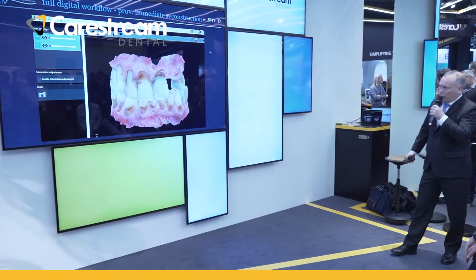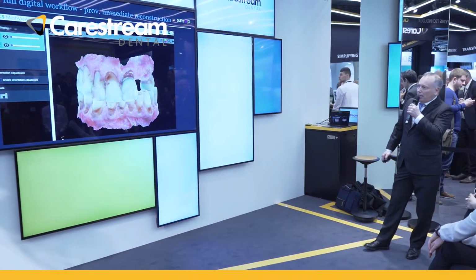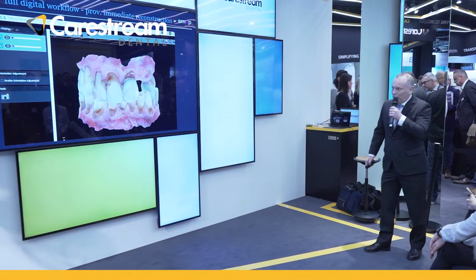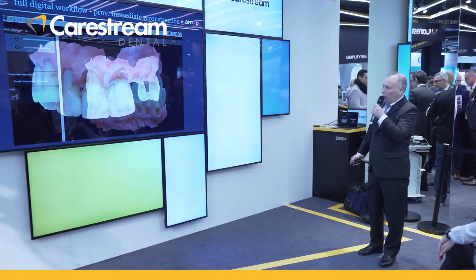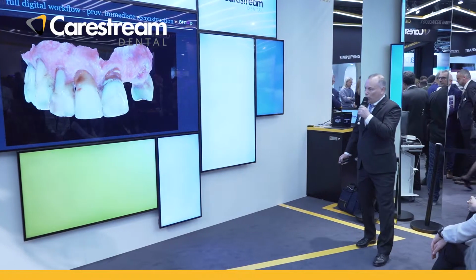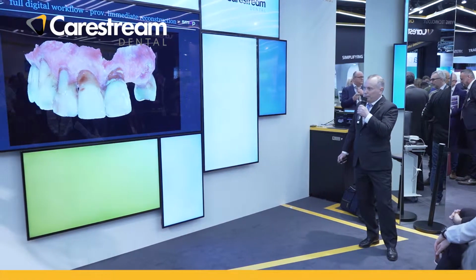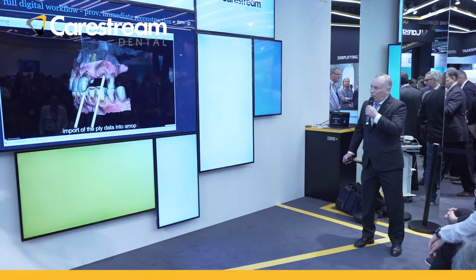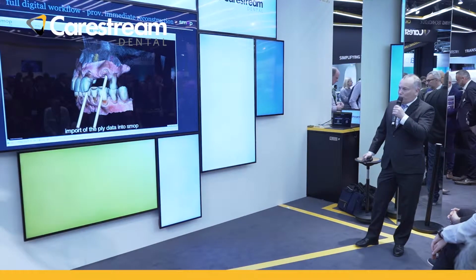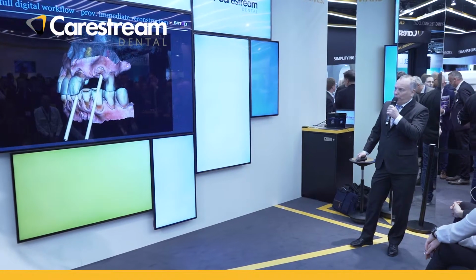I will show you later how this works. Here is the PLY data from the intraoral scan. I sent this data to my technician, and then I started to plan the position of the implants in SMOP.